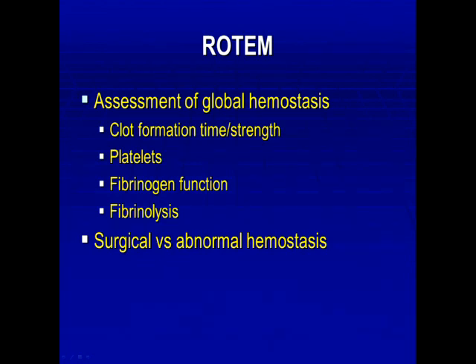Originally, when they came out with Rotem, it was marketed as a way to determine, in the OR, if you had a patient who was bleeding, whether or not it was surgical bleeding versus an abnormality in coagulation, if it wasn't apparently obvious in that case.